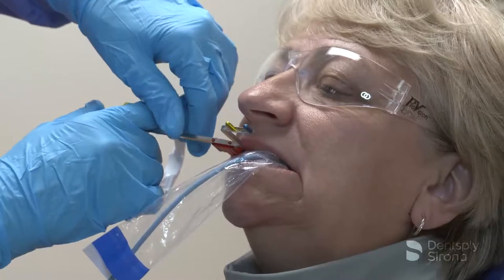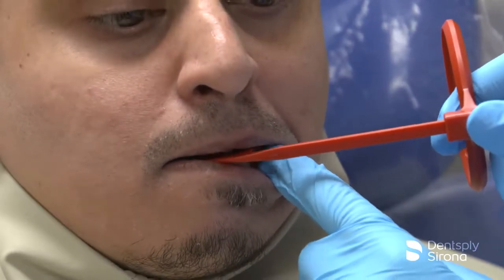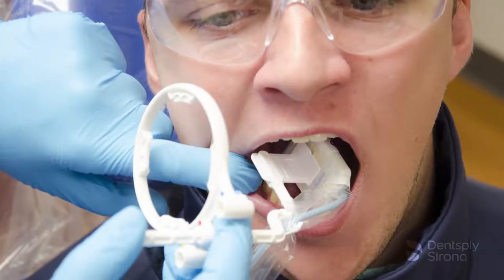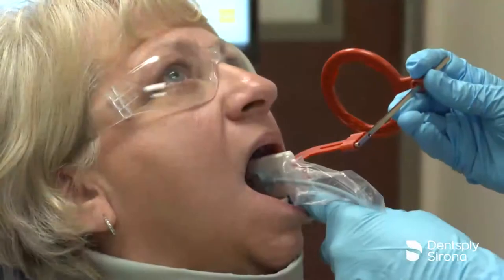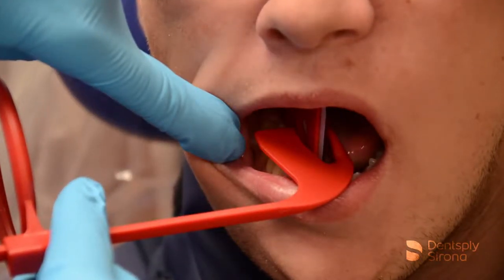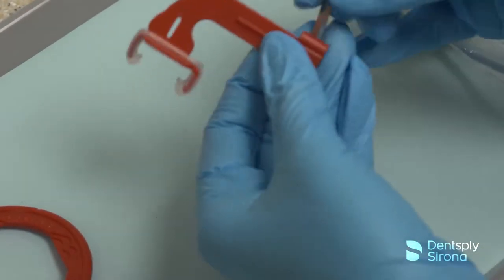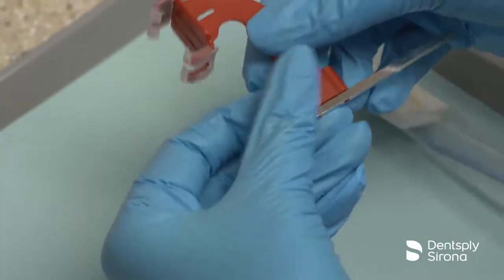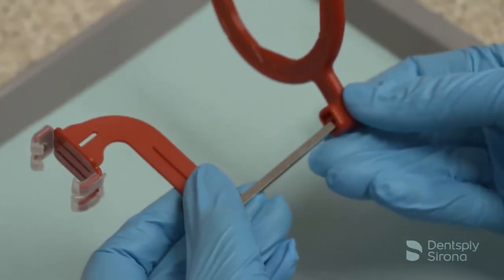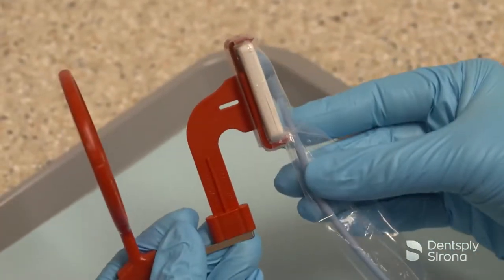Bitewing radiographs are considered part of the routine dental assessment. It may be five to seven years between full mouth sets, and bitewing x-rays are an important diagnostic tool to monitor disease and health during this time interval. To properly detect caries and periodontal disease, it is essential to capture open contacts between teeth and maxillary and mandibular bone levels. It is important to ensure that the central ray is perpendicular to the image receptor. To assemble the XCP short arm with the XCP DS-FIT bitewing bite block, place the red pins on the arm into the side of the red bite block and slide the arm into the red aiming ring. Securely insert the sensor into the red bite block, making sure that the active side of the sensor is against the flat surface of the bite block.